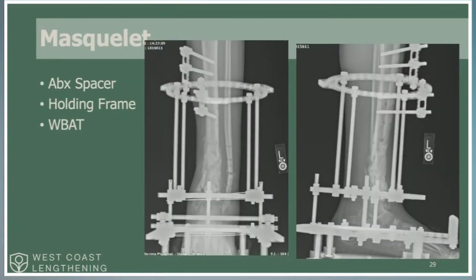And so we attempted a Masquelet. It's like, all right, we'll try. It's supposed to work. Distal tibias are hard, but he was young, healthy otherwise. Okay soft tissue envelope, but we put a spacer in for 6 weeks, then went back in, did some iliac crest bone grafts and allograft.